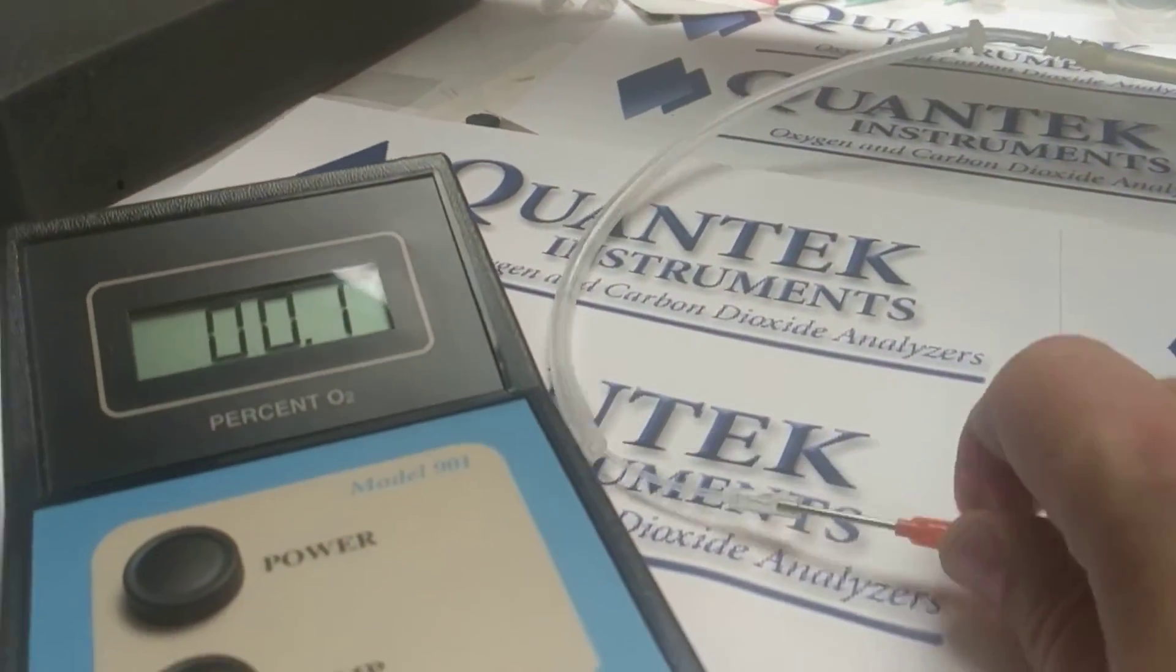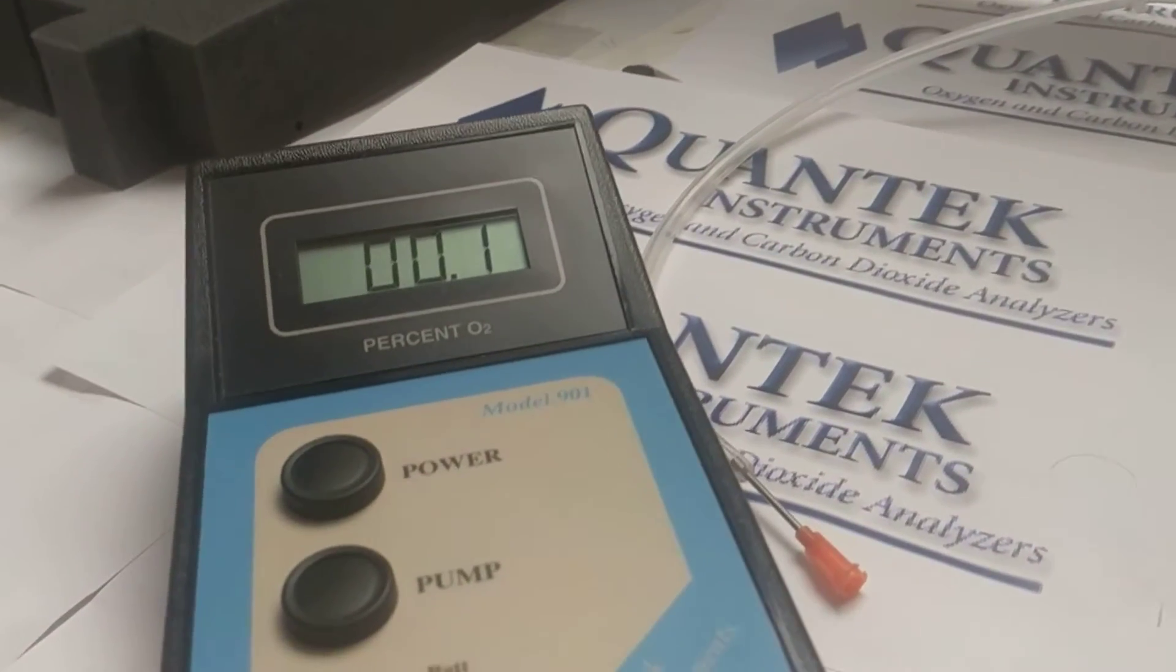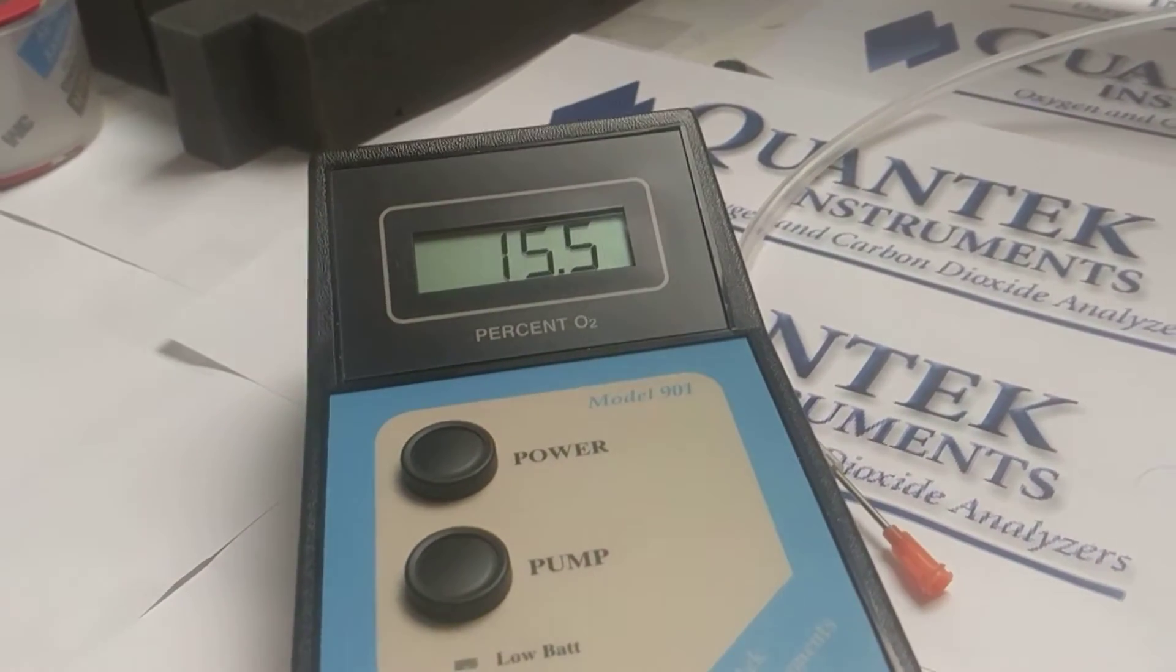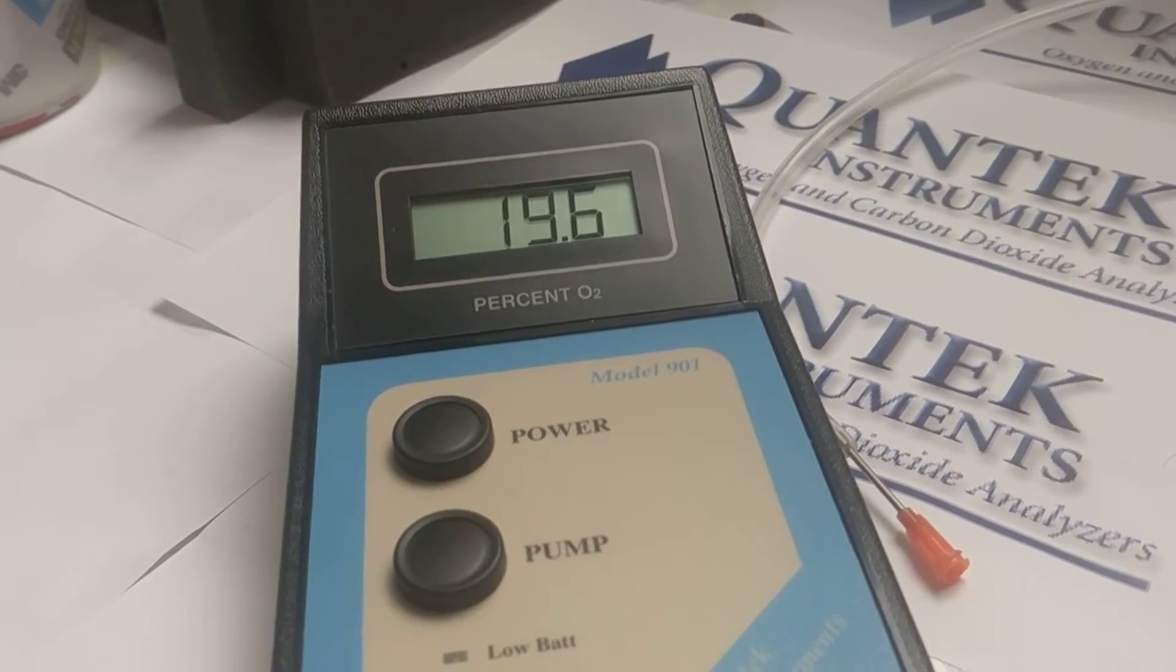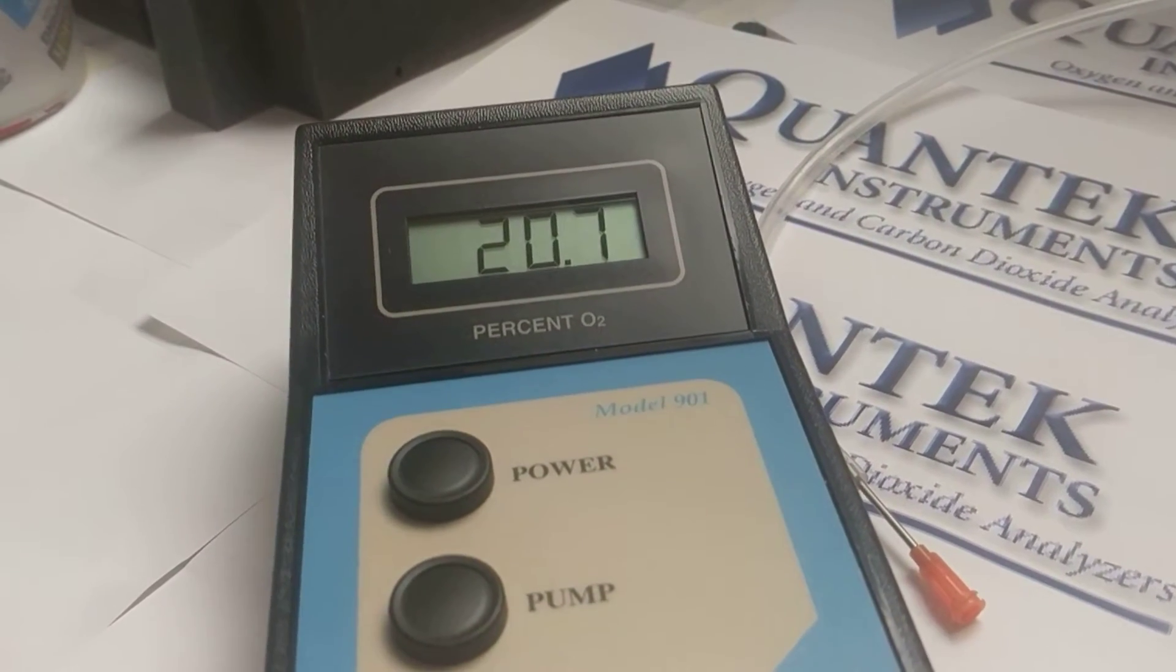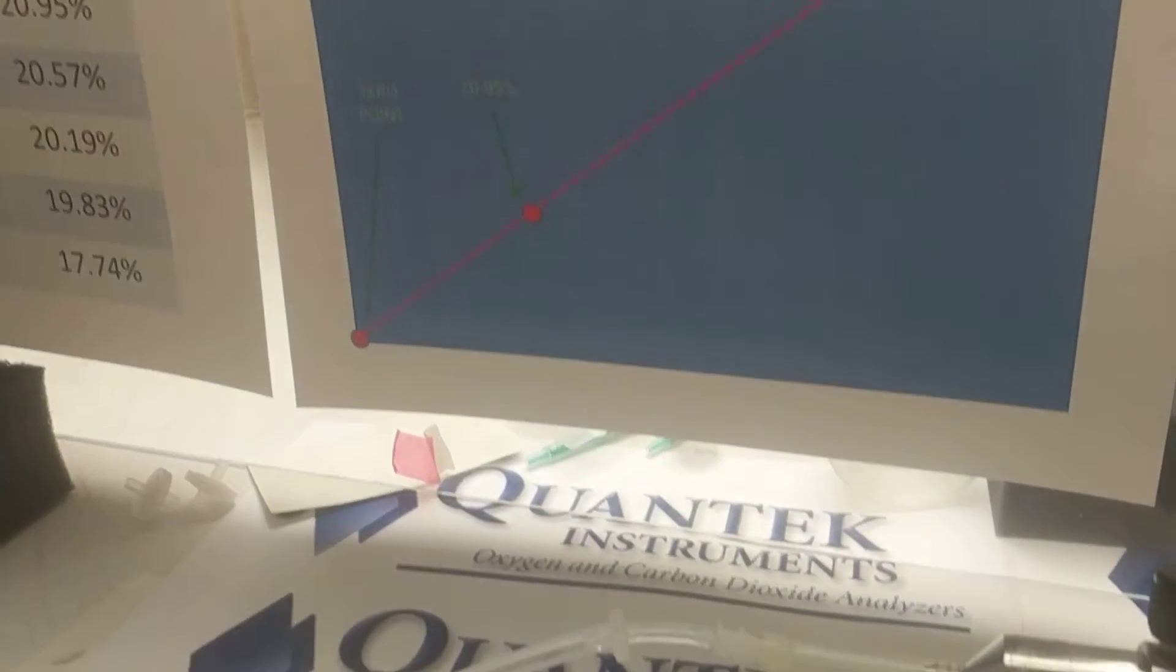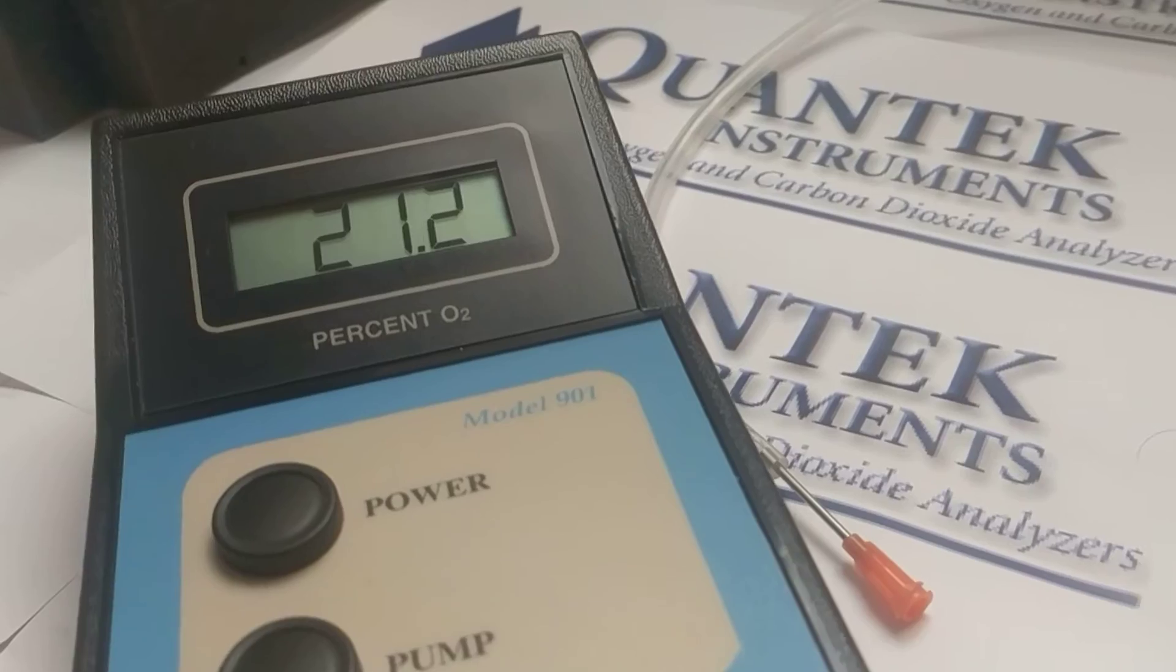Now we've just adjusted the zero point on the curve. So what we're going to do is we're going to disconnect the probe from the gas and we're actually going to press the pump button again. And what we're going to do now is actually adjust the span because any adjustment that you make to the zero will affect the span. I would expect that this would end up a little bit higher since we moved the zero point up. I would expect that the 20.9 will end up a little bit higher, and indeed it did.